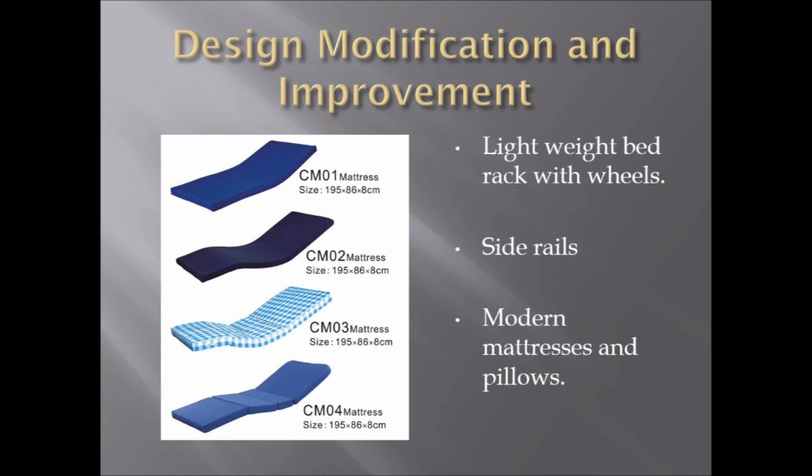Next, the bed has side rails that can be raised or lowered. These rails serve as protection to prevent the patient from falling from the bed. Other than that, hospital bed mattress systems are designed to bend with the positioning of the bed and patient. A standard bed mattress will not bend as the bed adjusts. Inner spring mattresses are the most common type of mattress supplied with the medical bed, mainly because of economy.